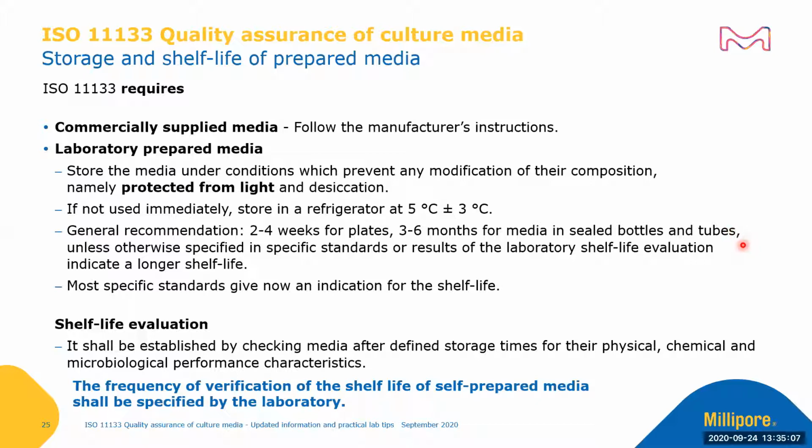Unless otherwise specified in specific standards, or results of the laboratory shelf life evaluation indicate a longer or a shorter shelf life. Most specific standards now give an indication for the shelf life. The shelf life evaluation itself shall be established by checking media after defined storage time for their physical, chemical, and microbiological performance characteristics. The frequency of this verification of the shelf life of self-prepared media shall be specified by the laboratory.